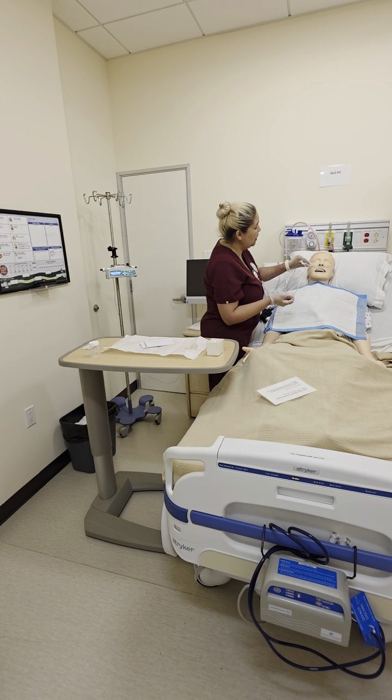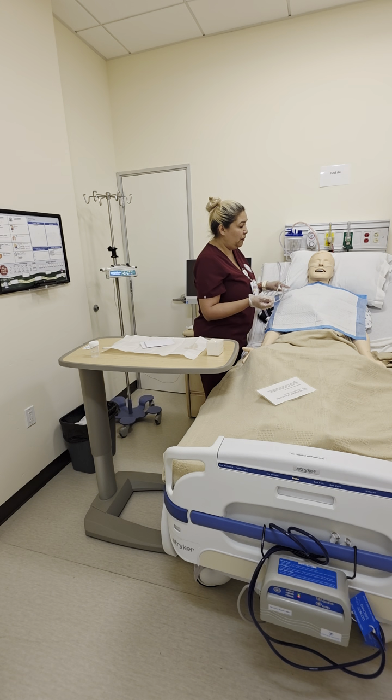Okay, again, same thing, you're going to take a deep breath. One thing also, before I go in and suction again, I want to make sure that the O2 sat numbers are still within good limits, that his oxygen didn't drop drastically while he didn't have oxygen on him, and that he's not having severe adverse reactions.